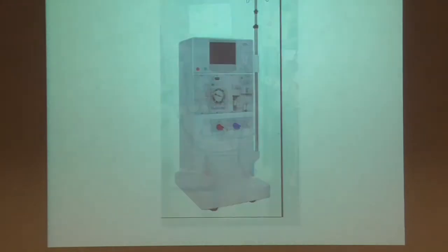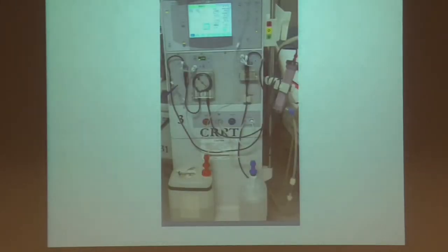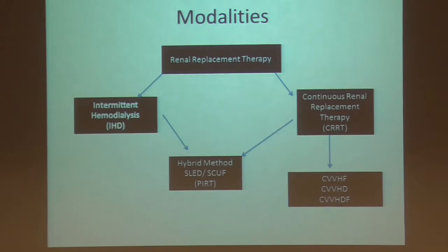So this is a regular dialysis machine. I actually took a picture of this. There's no patient data, but this is on the dialysis floor. Same machine. If you flip a switch, you can run it as a CRRT machine in the ICU. This method of dialysis came about essentially as a bridge. If a regular hemodialysis session is 4 hours, then this SLED treatment runs about 8 to 12 hours. 8 hours of SLED equals about 4 hours of dialysis.